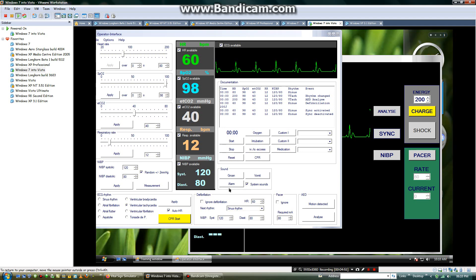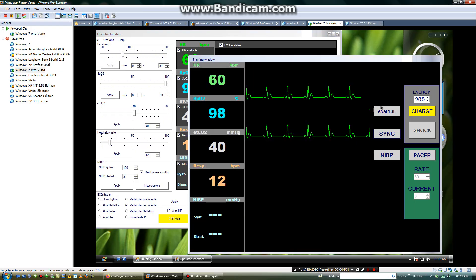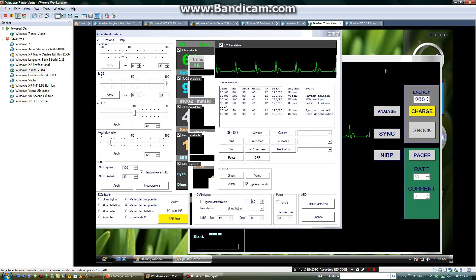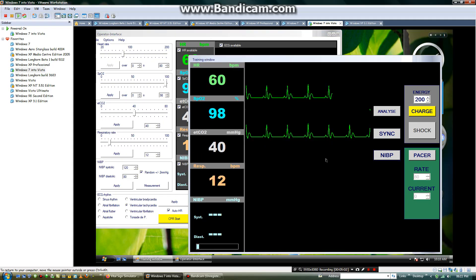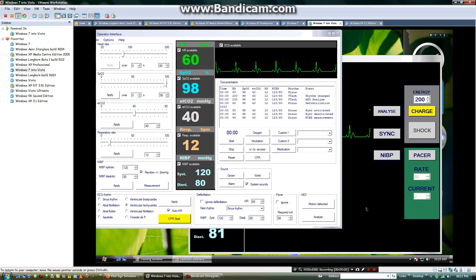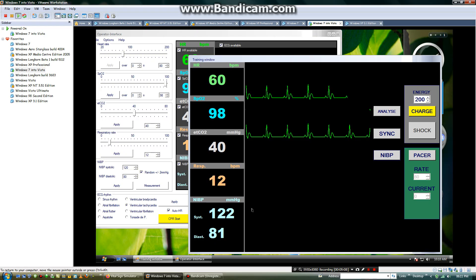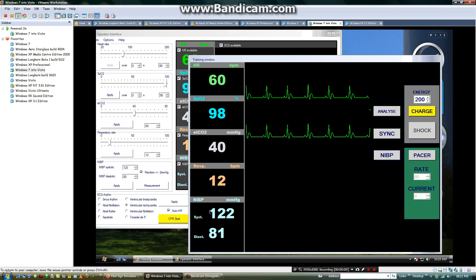Then, to start the NIBP. Just go ahead and start the NIBP. Then I will measure the NIBP. Then the NIBP is 122 by 81.